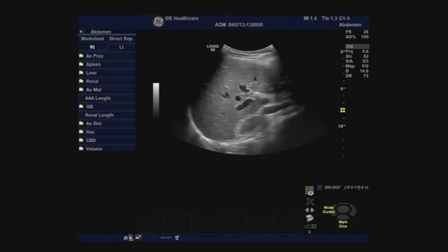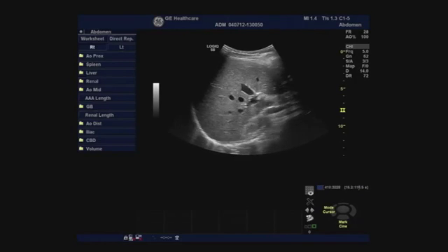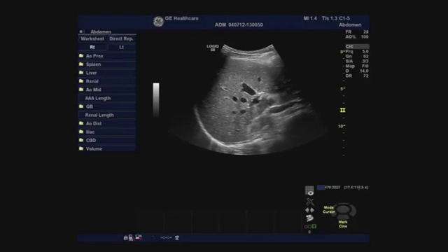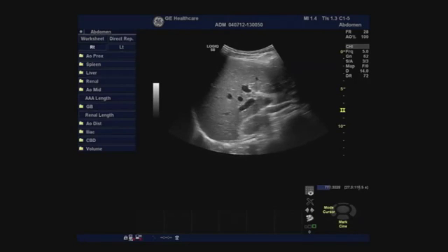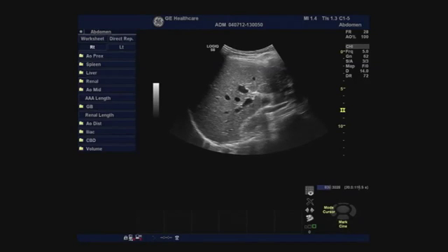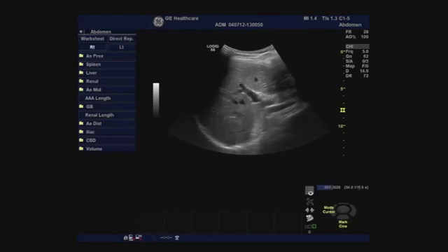And finally, the other main component I would probably want you to look at changing is SRI. SRI is an adaptive algorithm to reduce speckle, unwanted speckle within the ultrasound image. And on the system, on the touch panel, you have SRI, and at the moment I'm using an SRI of 3. If I go down to 0, you can see my image is very speckly.